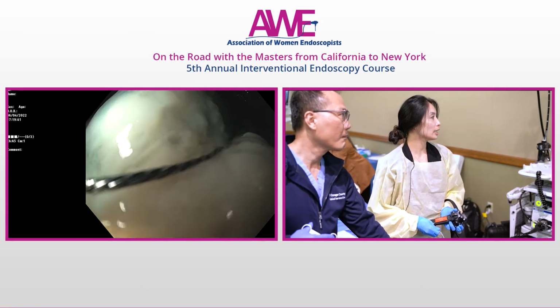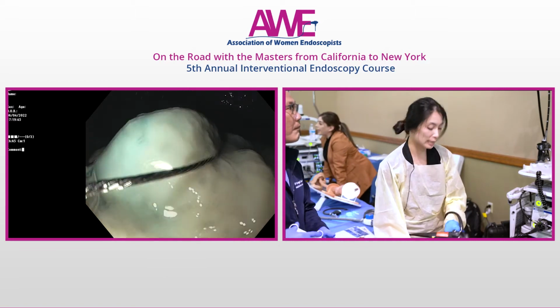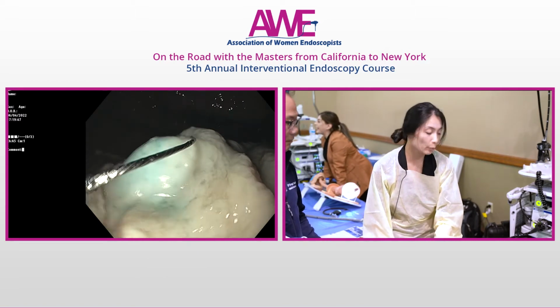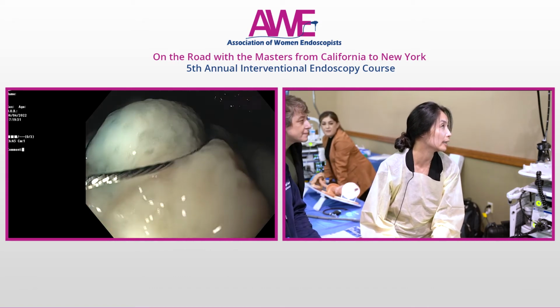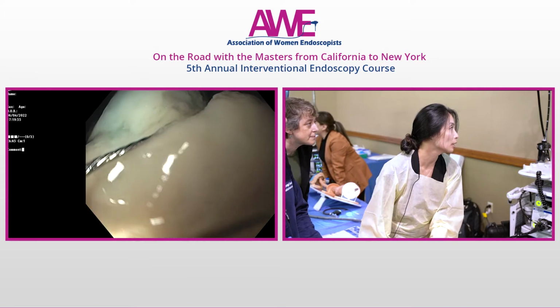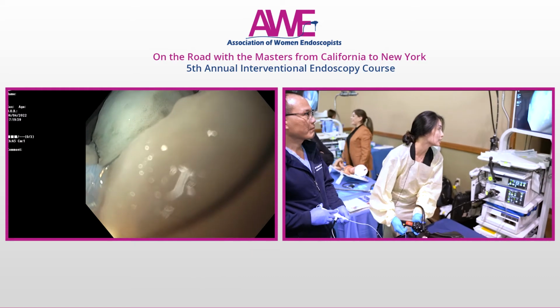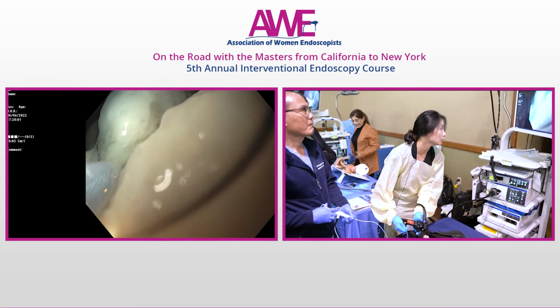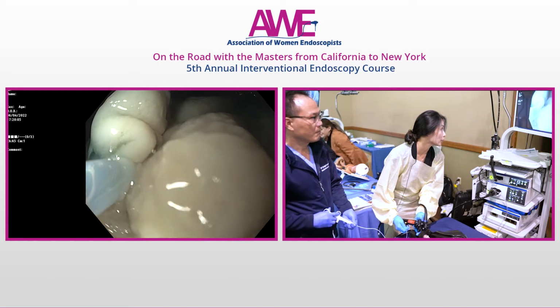So we're suctioning and keeping a downward force. I can hold both my scope and the equipment at the same time by using my left pinky, and I can lock my wheels in position to make it more stable. I'm suctioning and asking my assistant to close at the same time. Keep closing, keep closing, keep closing.